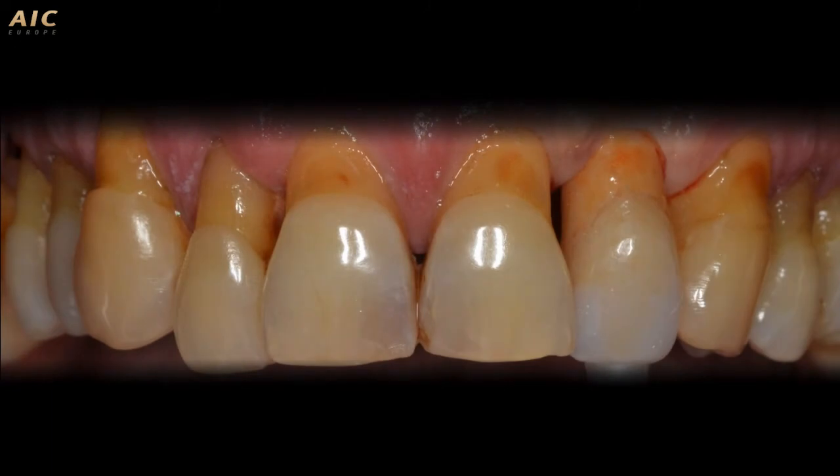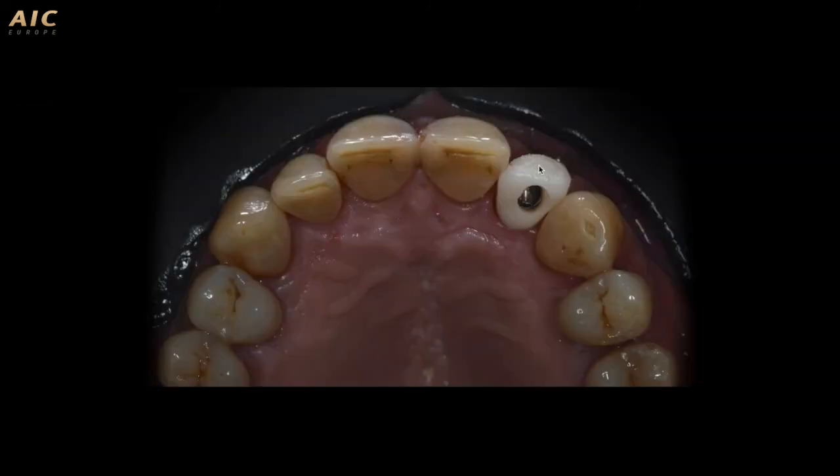Then thanks to this try-in, we can produce the zirconia monolithic crown, and we can work in serenity because we have all the information.